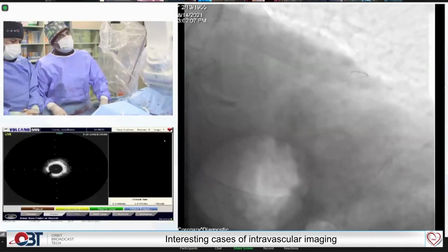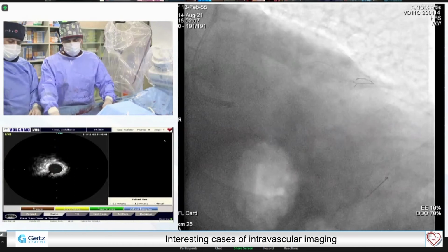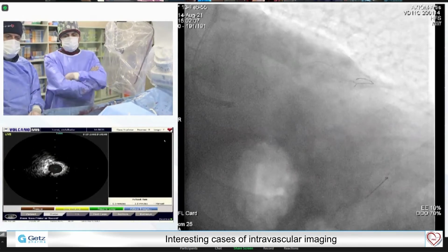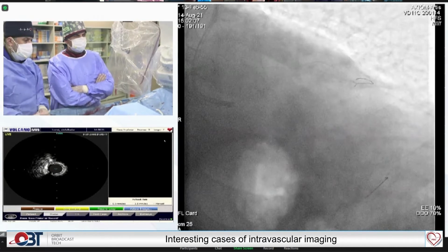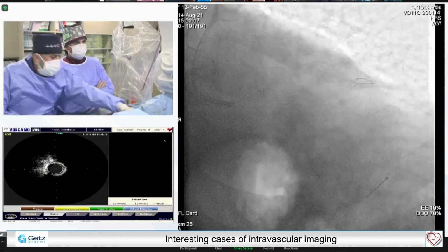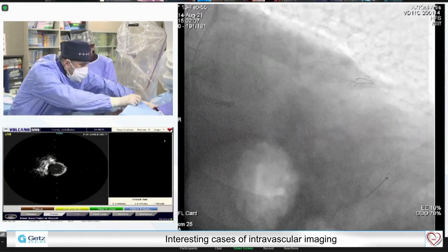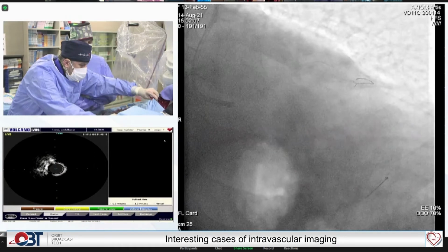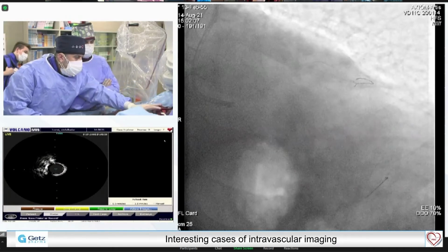What do you think? Shall we put the first proximal stent? I like to do it. One option would be to put your IVUS back in, and where you can see on IVUS a good distal landing zone, mark that on fluoro or cine, without dye obviously, and then start distally from there and stent backwards. I would prefer distal stent first.